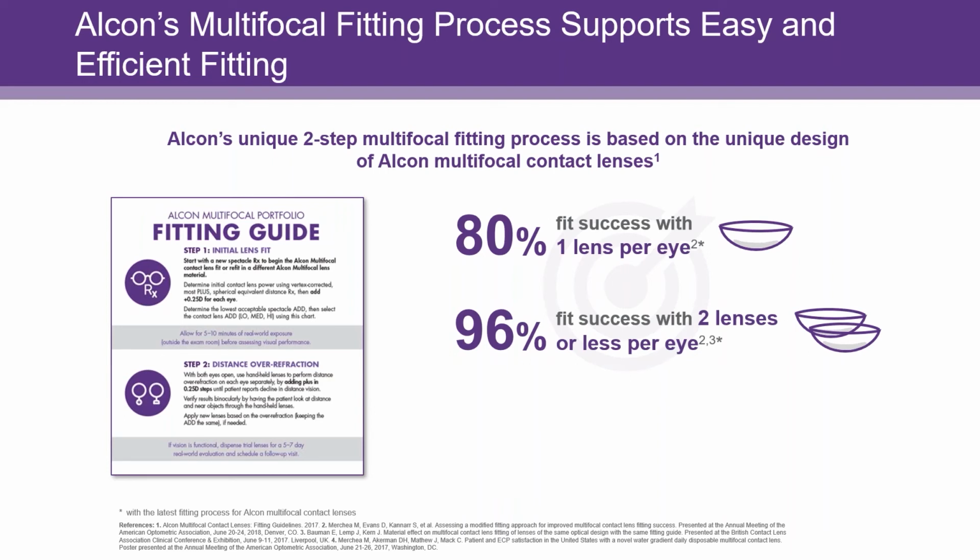Right. So at ODwire, we are constantly up against some people who say, "Oh, I can't do multifocals because it takes too much time." Now, in the olden days, back in your day, I could believe that. It took time. You charged accordingly. Yep. But it was a lot of chair time. But these days, I think with the newer designs and with the fitting guides, the process has become refined enough that it's becoming faster.